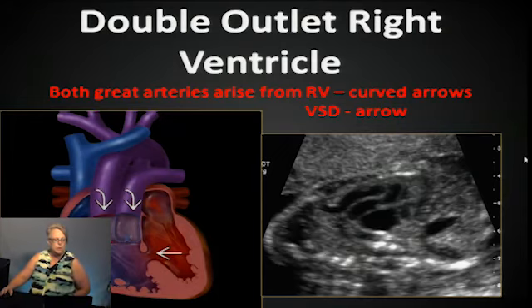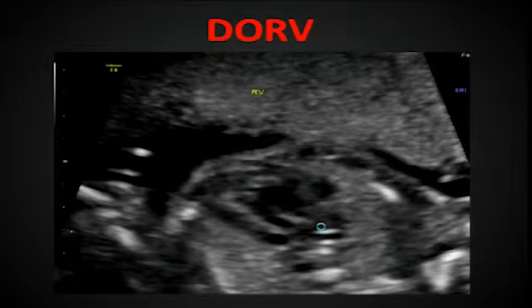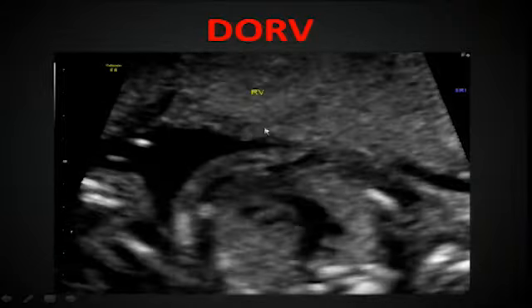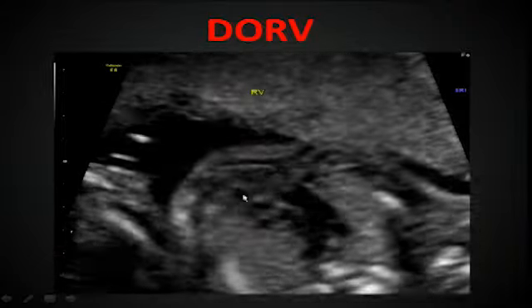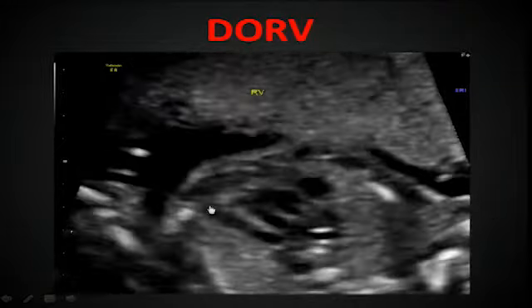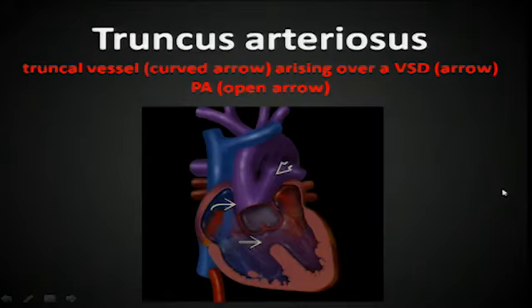Double outlet right ventricle, we've got both arteries arising from the right ventricle. So we've got both vessels. We see the septum here, but both of those arteries are arising from the right ventricle, and then usually with a VSD. So we're looking at the right ventricle, both great arteries coming out of the right side. And this in real time. Kind of similar to what you had with your transposition, but now we've got both arteries on the one side of the septum. So the septum is here, both great arteries coming right out of the right ventricle.